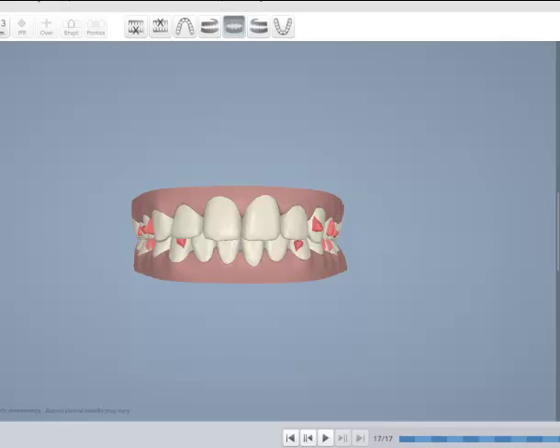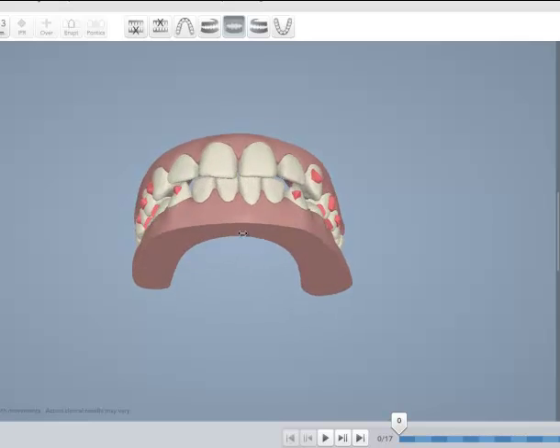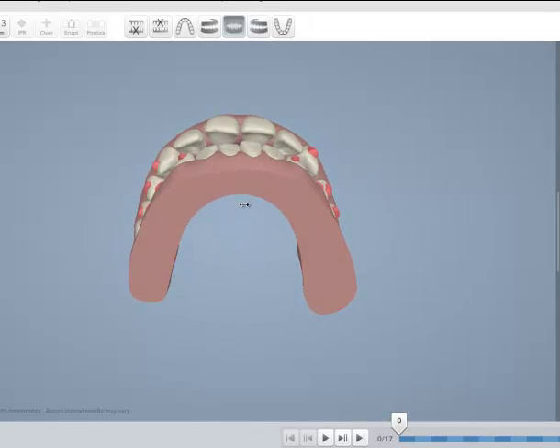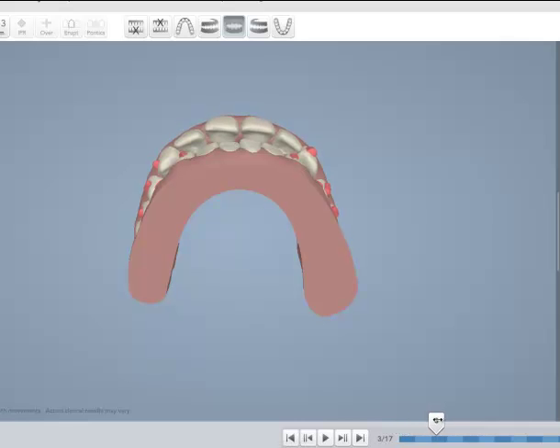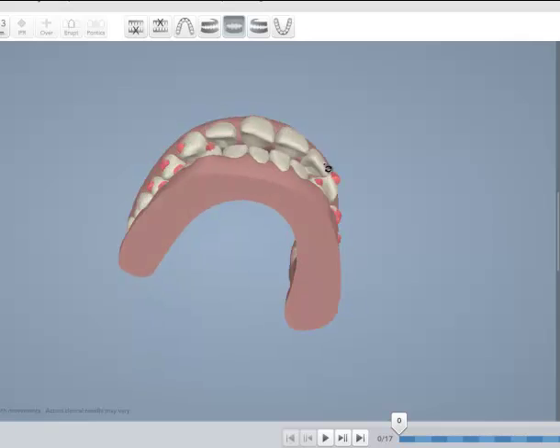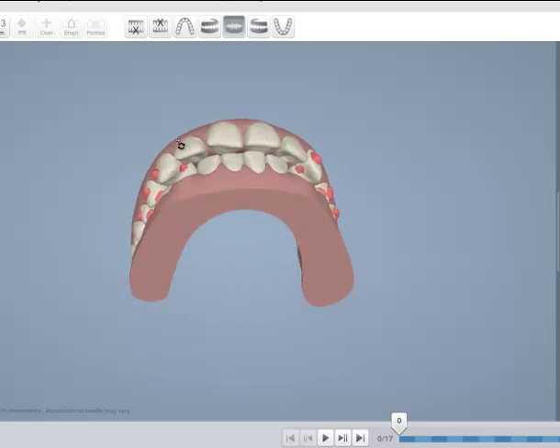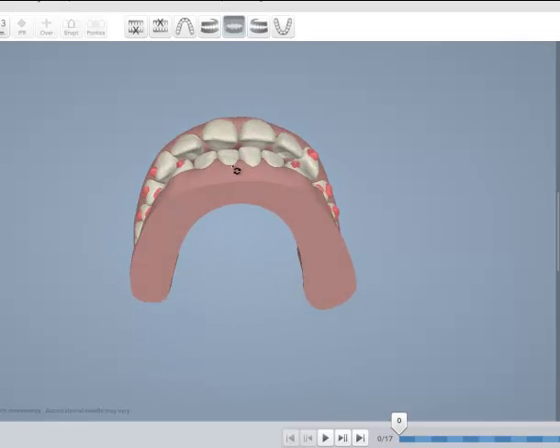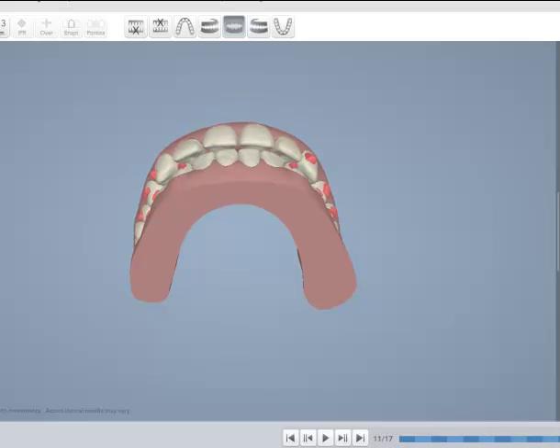Let's look at it from a different angle, the side view. The patient could afford to have the incisors retracted. It would have been more complicated if we had to protract or labialize the lower incisors, which are actually well positioned on basal bone. You can see all we're doing now is filling up the spaces with retraction of the incisors.